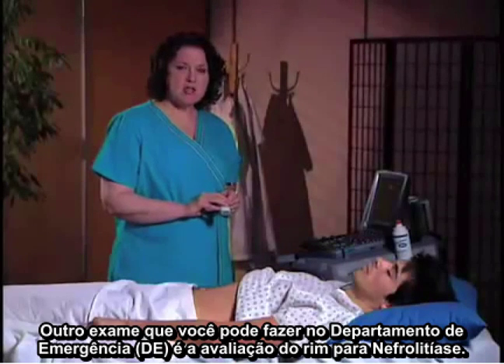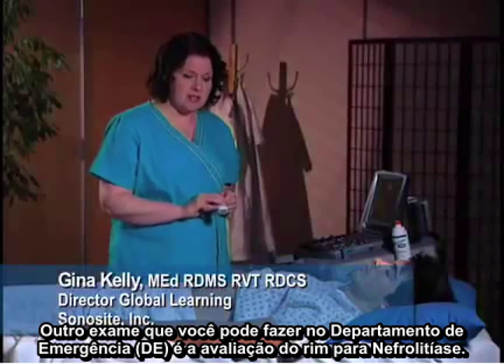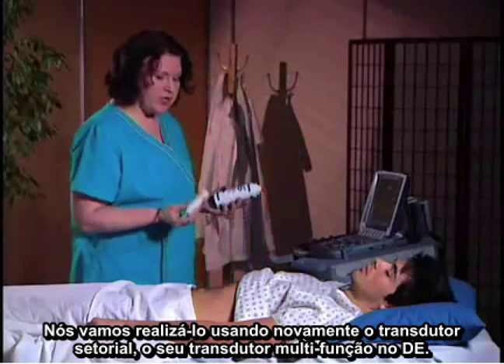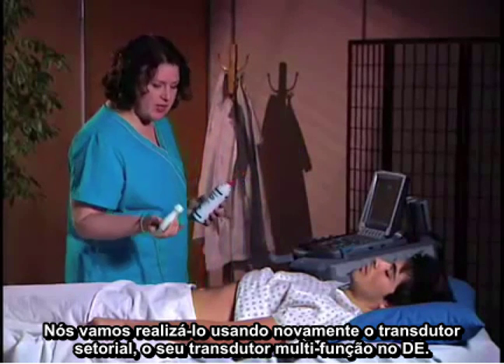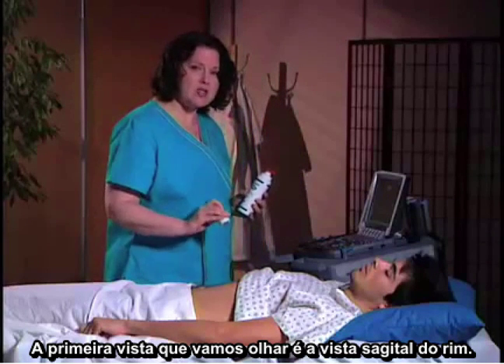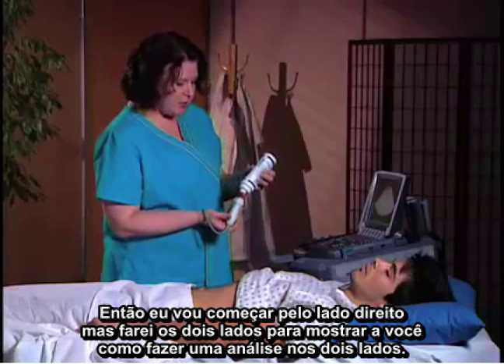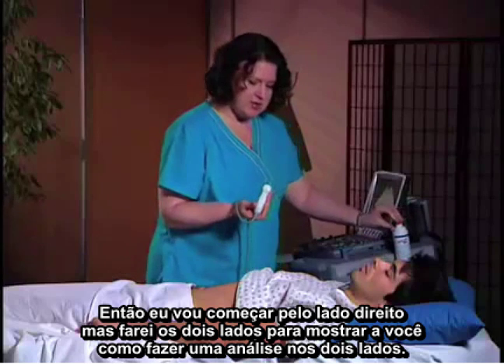Another examination you can do in the ED is the evaluation of the kidney for nephrolithiasis. This is a relatively easy examination to do. We're going to use, again, the phased array transducer, your all-purpose ED transducer. The first view we're going to look at is a sagittal view of the kidney. I'm going to start on the right side, but I will do both sides to show you how to do an evaluation on both sides.